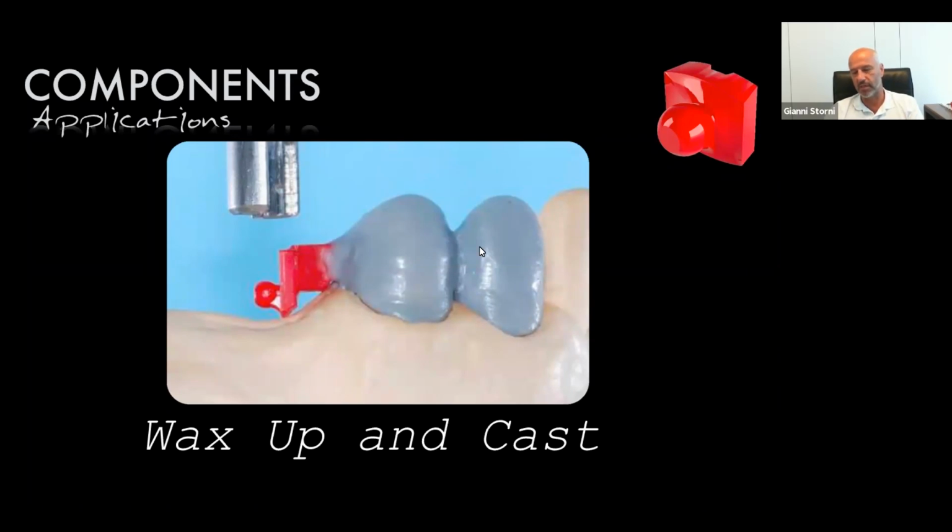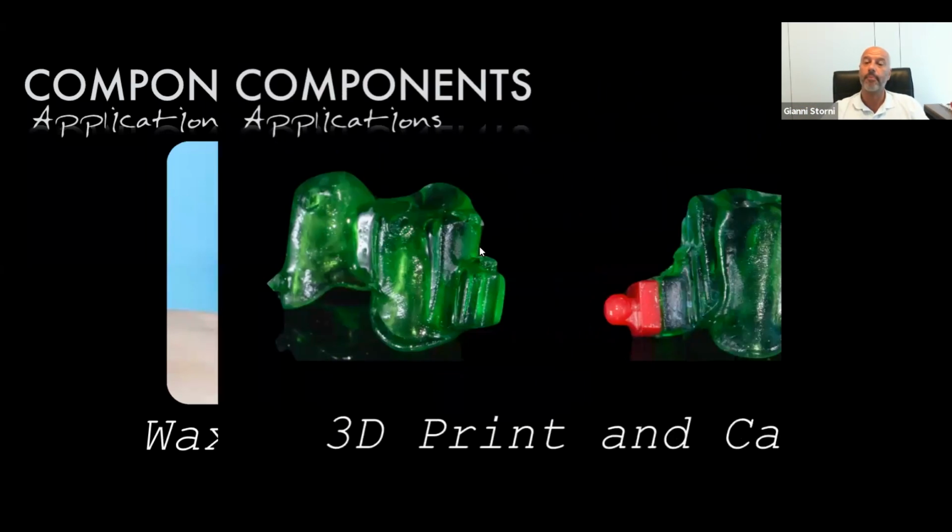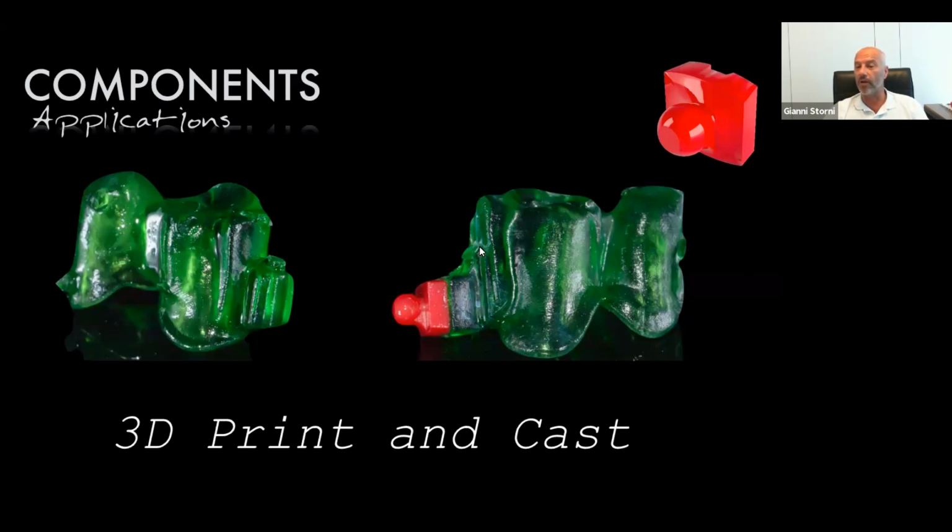We of course suggest a hard metal, as almost everyone knows in Greece, because you are one of our oldest areas of users. Then we follow the technology, also trying to save cost. The castable solution, we all know, is an economical way to go.